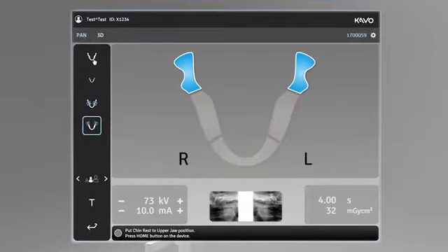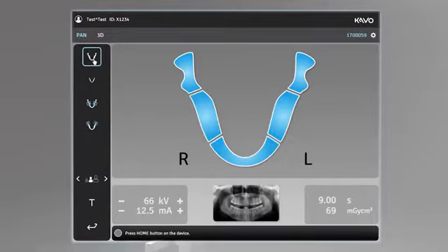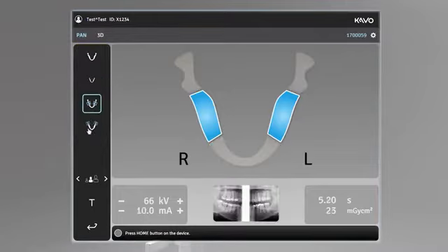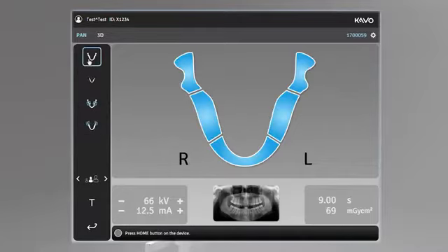With the Panoramic Imaging Program selected, you can select the imaging modality. Press the imaging program icons to change the active imaging program. There are 4 imaging modalities that can be selected from the screen: Standard Panoramic, Pediatric Panoramic, Bitewing, TMJ. The Standard Panoramic Imaging Program provides a general view of dental and facial anatomy, typically seen for adolescents and adults.